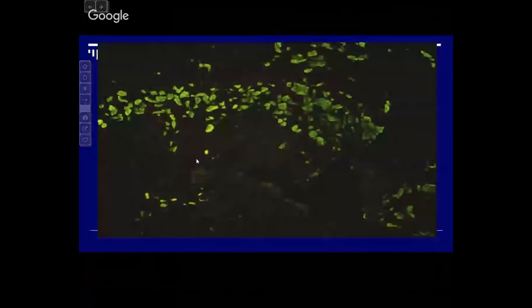When you do immunofluorescence on lichen planus, you're going to see colloid bodies that are highlighted with IgM and C3 many times, and this can be on your board. So what do you see on immunofluorescence on lichen planus? You're going to see colloid bodies that are highlighted by IgM and C3.